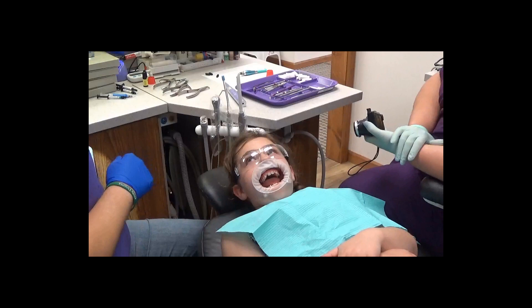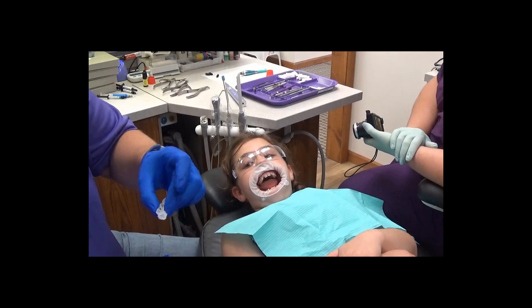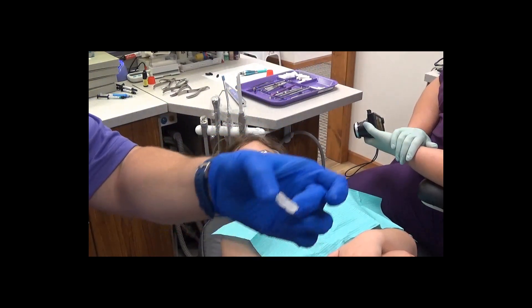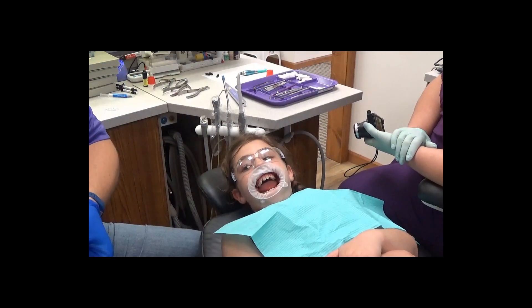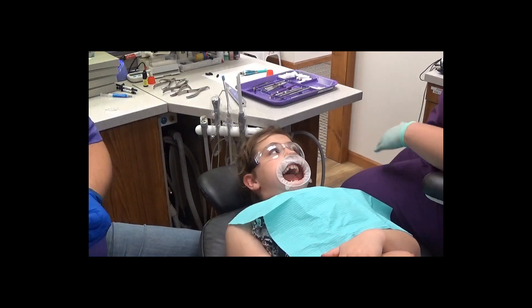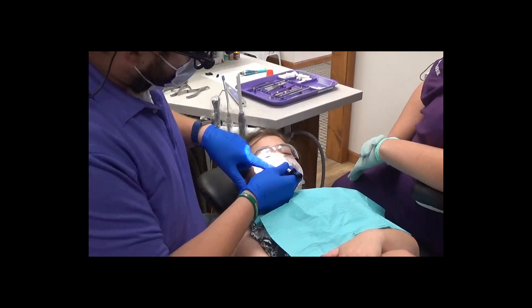Here we are delivering the indirect bonding trays. As I said in the previous videos, I like to cut them up into quadrants so that it's a little bit easier to seat and also to keep isolated. My assistant Sarah has already flower pumiced the teeth, and now I'm going to be using a little cleaning boost.